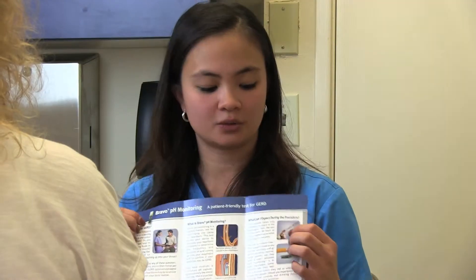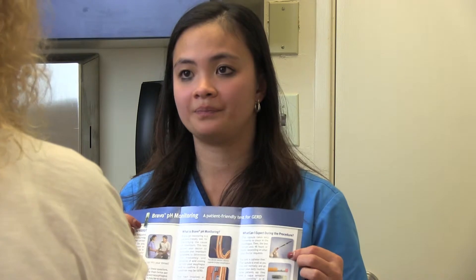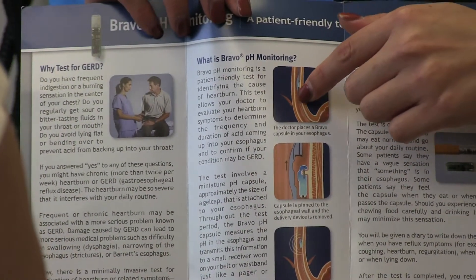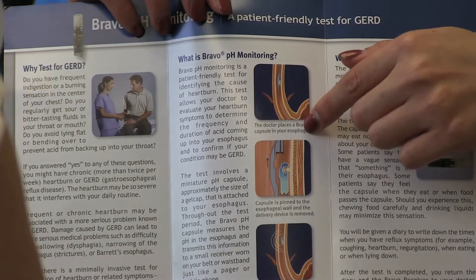Dr. Simoni wants you to have a Bravo capsule placement. The capsule is attached to a wire, and that wire will be guided down into your esophagus where it will sit six centimeters above the sphincter in between your esophagus and your stomach.